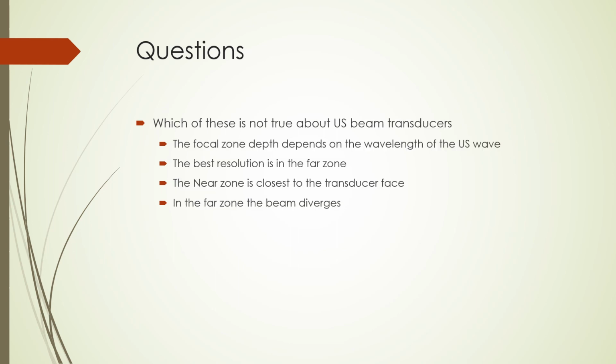This is the next question. Which of these is not true about ultrasound beam transducers? And I will give you a few seconds to look at it and then display the answer. The correct choice is the second choice. The best resolution is in the far zone. That is not true about ultrasound beam transducers.